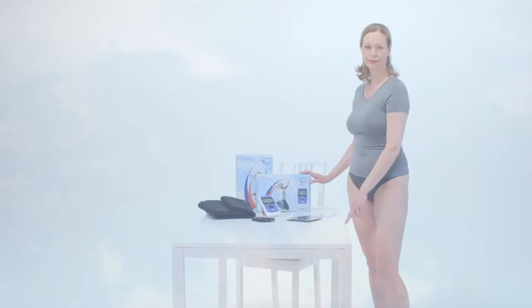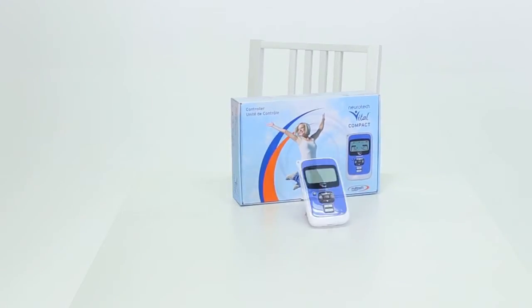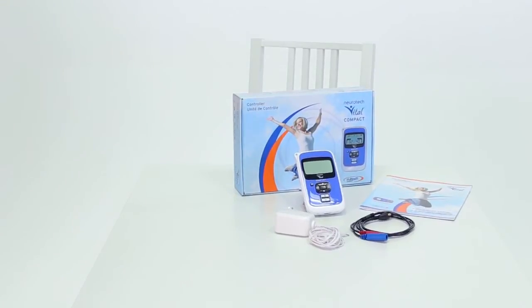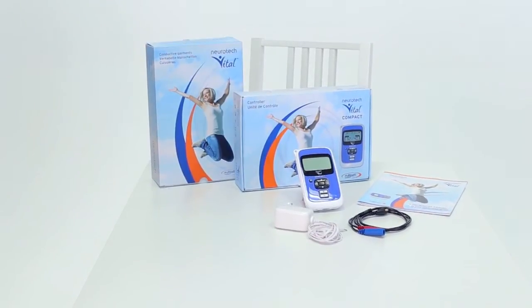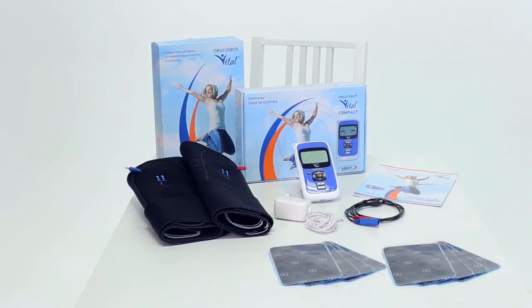The therapy device comes in two packages. In the first one, you'll find the controller, the lead, the charger, and the instruction manual. The second package contains two garments, eight electrodes — four for each garment — and a quick start guide.